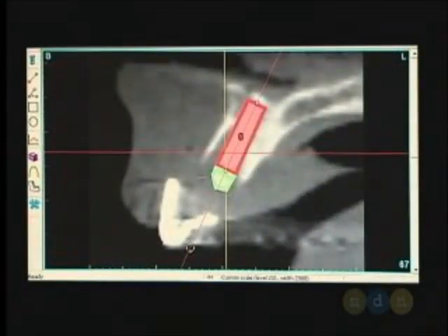closer look. Here is the teeth. This is where the radiopaque marker is for the central incisor. Here's the angulation and the length of the implant, and I can choose the type of implant I want. In this case, this is going to be an ankylose implant. This is going to be the transmucosal part of the abutment. This is the area that's underneath the tissue, approximately 1.5 millimeters. And this is the radiographic, radiopaque part of the tooth form.